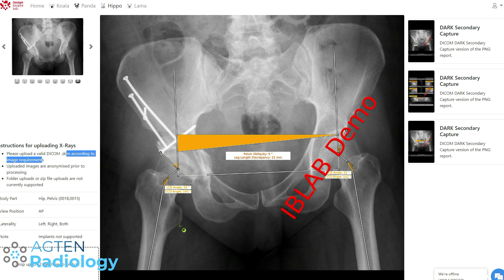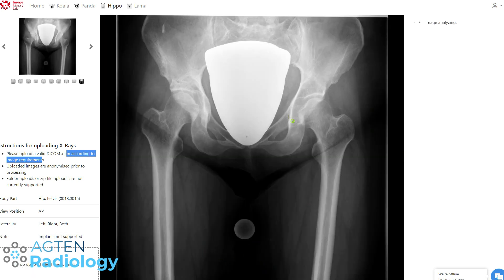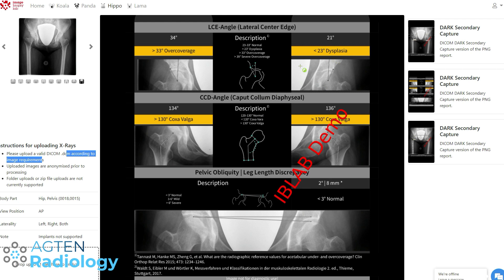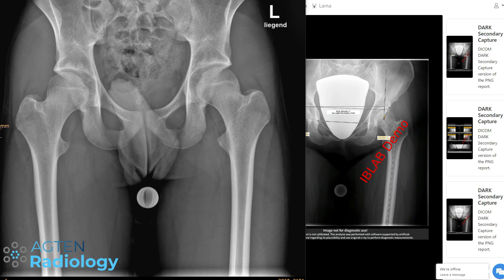I've got one last one. I picked this on purpose: you can see there is a radiation protection device here for the ovaries in this female patient. We'll see how it deals with this, because technically it should not interfere with these measurements. It does not interfere — the points all look on point. It's showing dysplasia on one side, and on the other side it's better, probably after surgery.